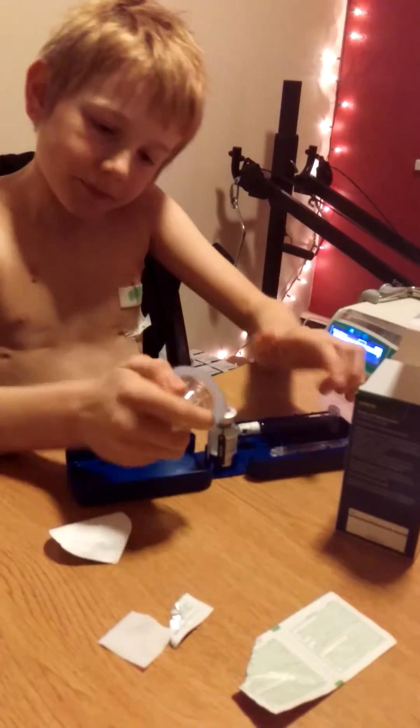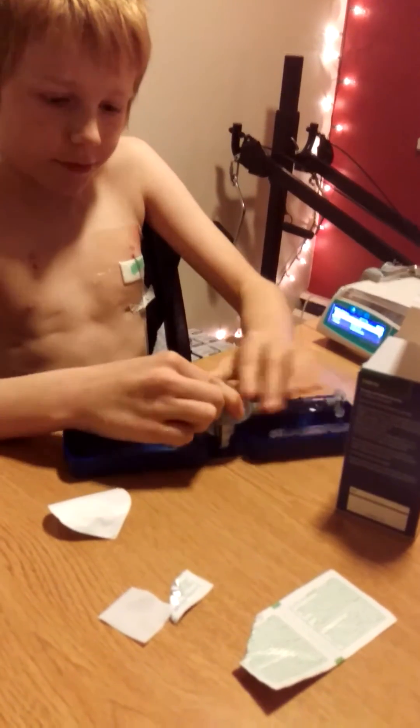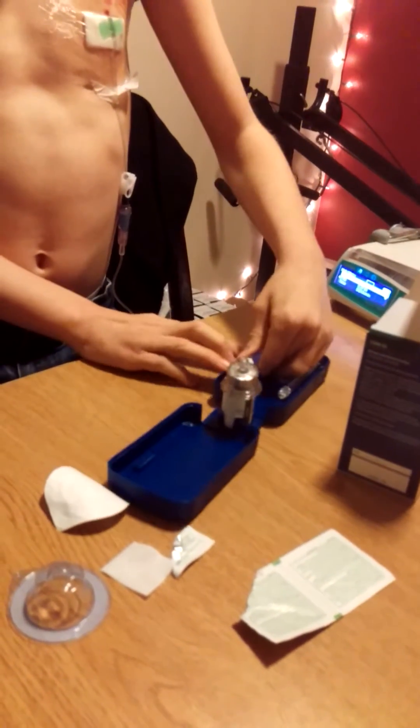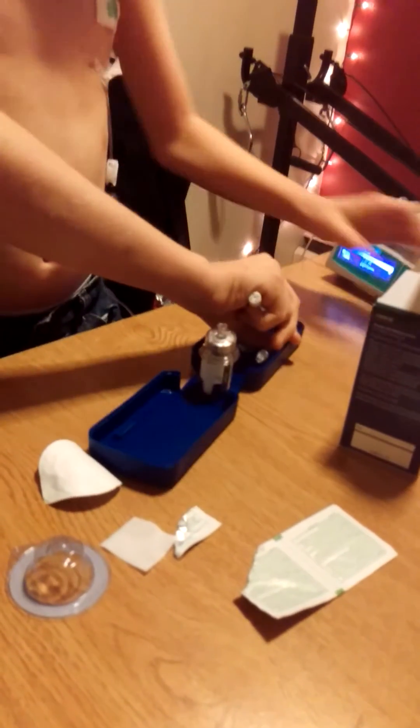Open it like this and then put it on like this, just like the FIBA. Then it's like that. Dad, do you screw in the plunger first? I do, yeah.